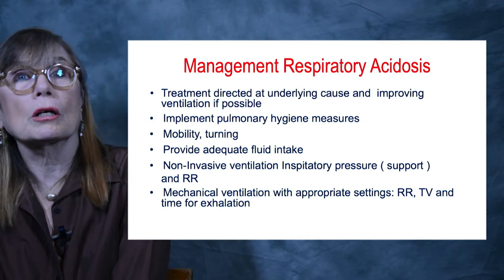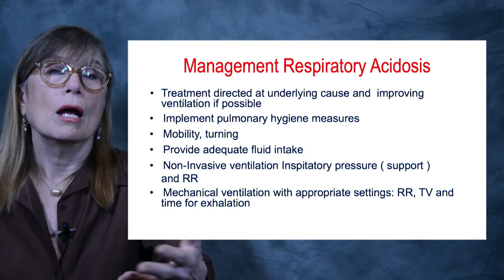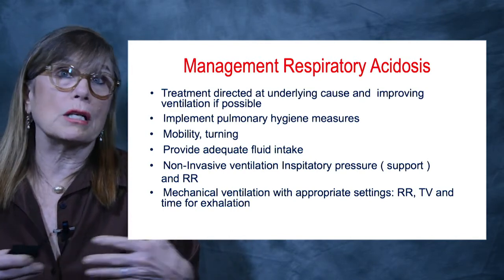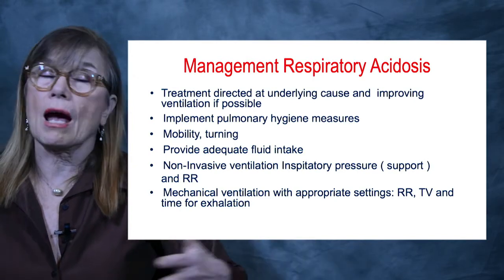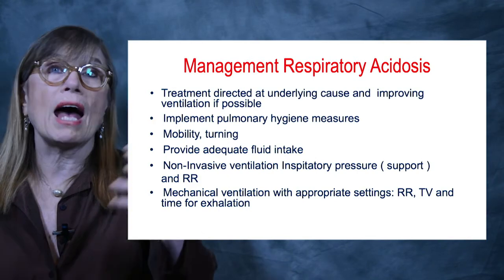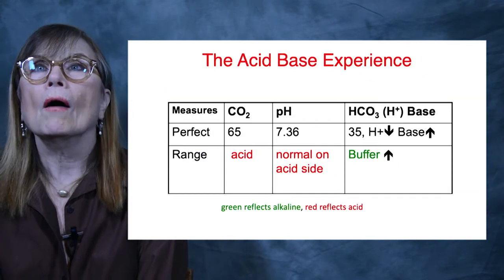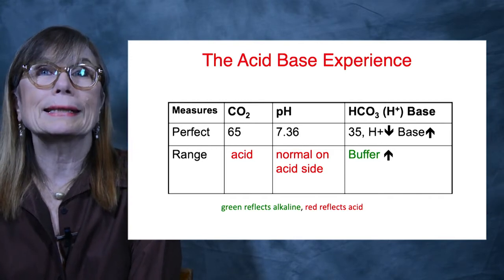And also, we're going to look at time for exhalation. How long are we allowing you to exhale? And remember, in patients who are CO2 retainers, time is of the essence. They have to have a lot of time for exhalation. So we have to deliver gas in really fast and allow them a lot of time to exhale to get rid of CO2. All right, so let's take a look at a blood gas now.